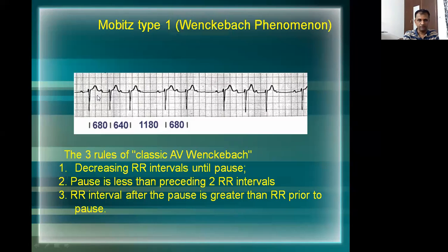If you look carefully at the interval or gap between these, from here until here, it slightly widens here, and if you follow it, subsequently there is more widening here, and then this long gap. What it means is the PR interval keeps lengthening until a beat is skipped, and then it becomes normal again and keeps continuing the same thing.